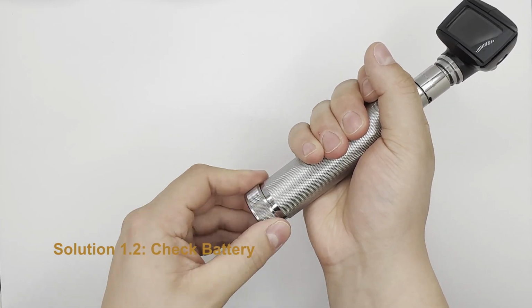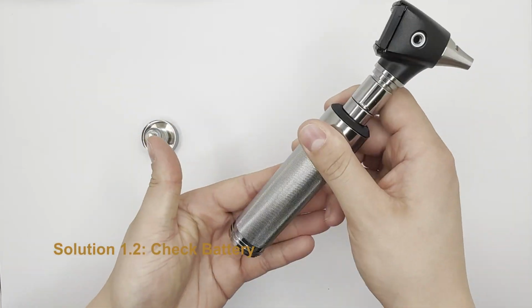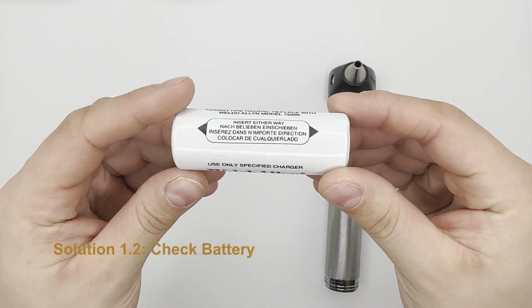If charging the battery doesn't work, it's possible that it can no longer hold a charge or is damaged. Remove the battery from the handle. This involves unscrewing the cap on the bottom of the handle and firmly tapping the shaft of the handle on the palm of your other hand until the battery shakes free.